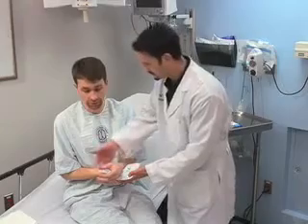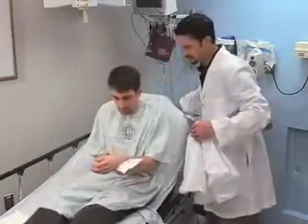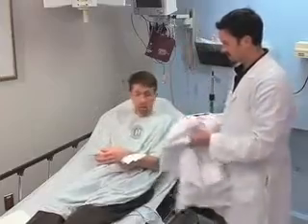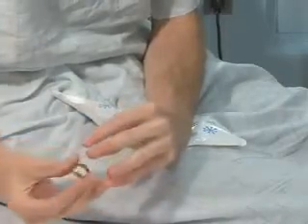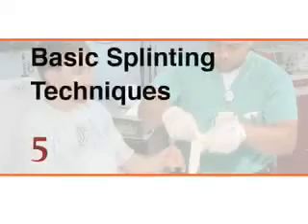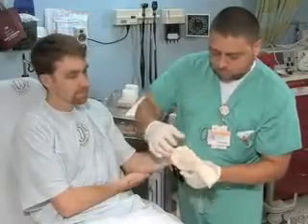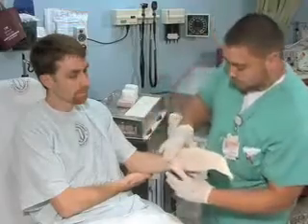Analgesics or anesthetics may be necessary to control pain during the splinting procedure. Place the patient in a comfortable position that allows you to have adequate access to all sides of the injured extremity. Remove all jewelry from the involved extremity before beginning splint placement. This section demonstrates the application of a volar splint to an upper extremity.